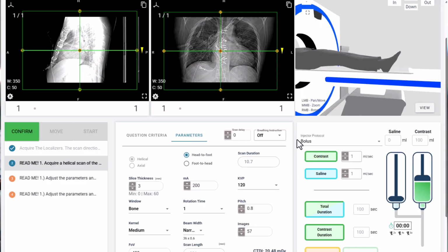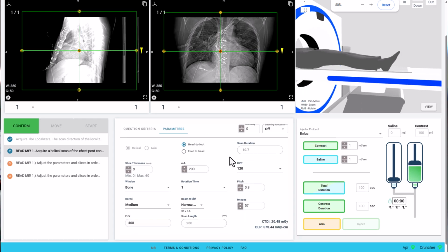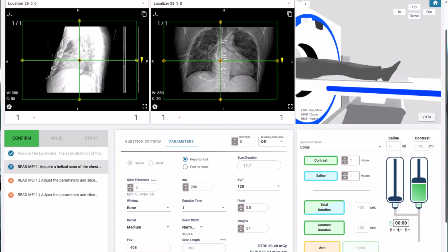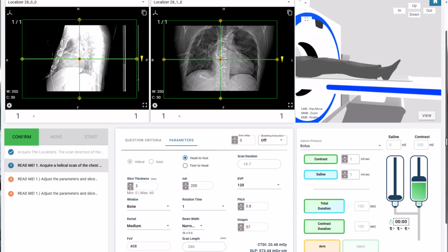Also, it's really important that you know that within the ScanLab interface, just like anything on Windows, you can hold down Control and plus or minus, or use your middle mouse wheel to change the aspect ratio of the ScanLab interface. And you'll need to do that because we really don't want you to have to scroll up and down, so take your time and make sure to do that.